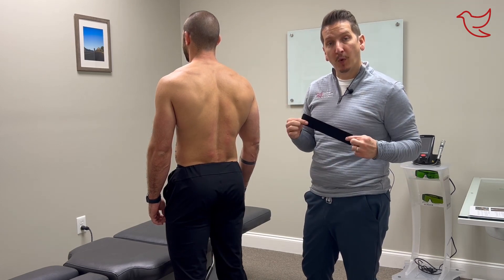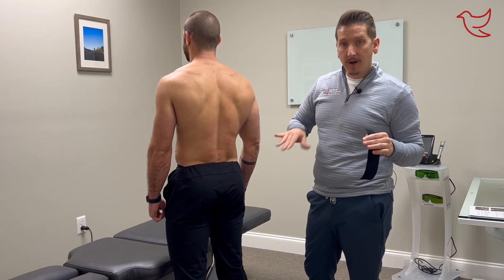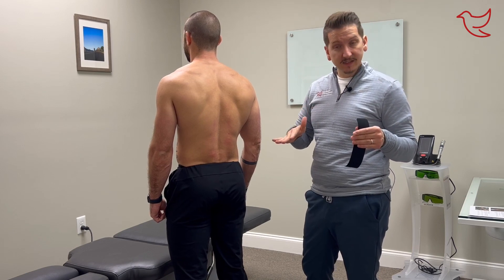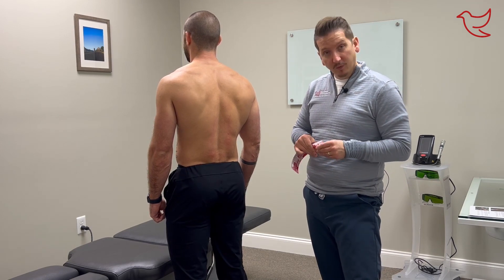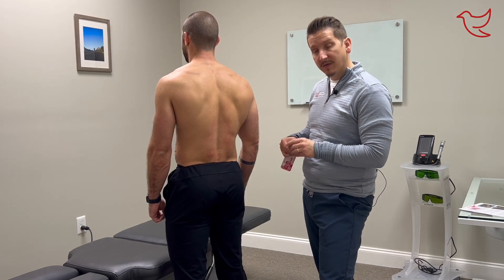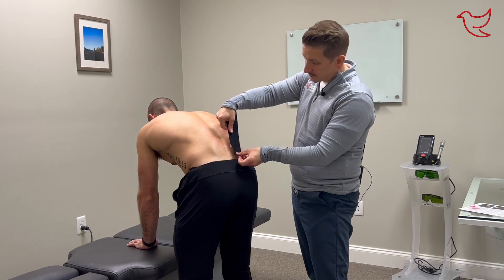This tape is fantastic — it's going to support you for a couple of days after your appointment. Usually the effectiveness level is about three days. Towards the end of the third day, if it's still on, you can start to take it off gently. When we put it on, we are just trying to support this area and put some tape directly on the muscles that are hurting. So Daniel, lean forward just a smidge — there you go.